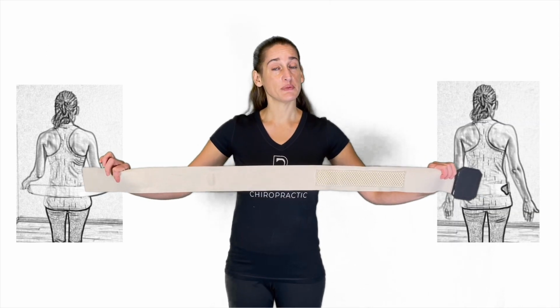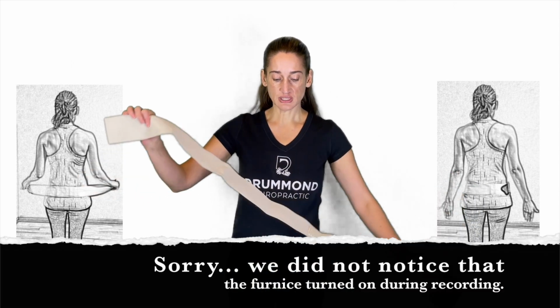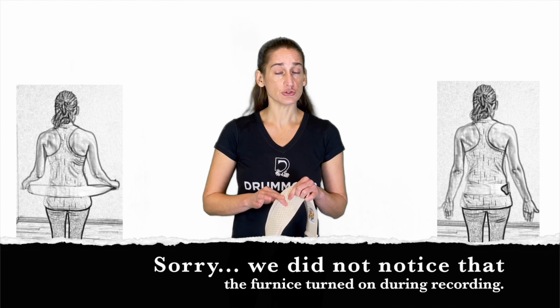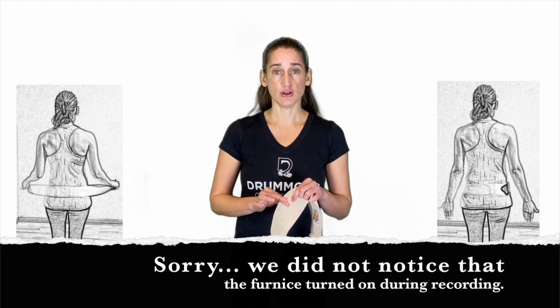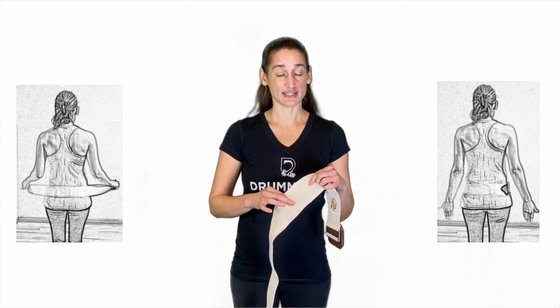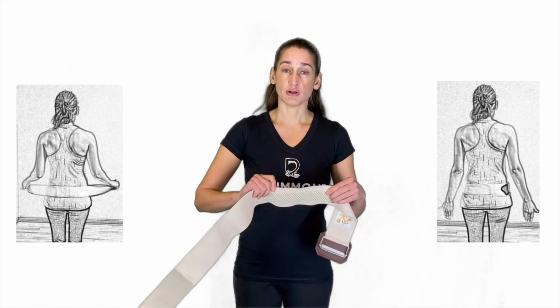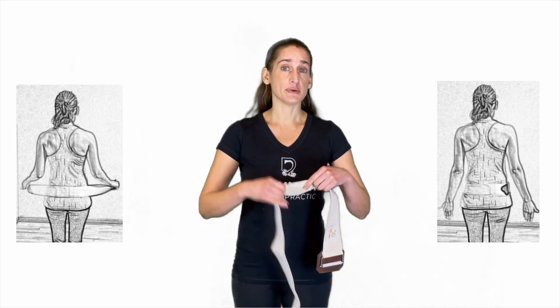So this is what the SI belt looks like. And as you can see, it has material here that's kind of sticky. You do not want this against your skin because it can irritate your skin. What I personally did when I sprained my SI joint is I would use a tank top, put the SI belt over the tank top, and then put on my underwear so that I didn't have to mess with that SI belt every time I went to the bathroom.